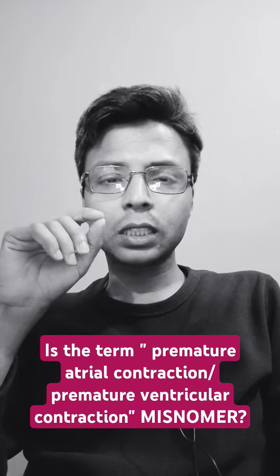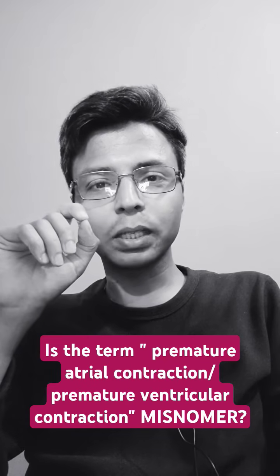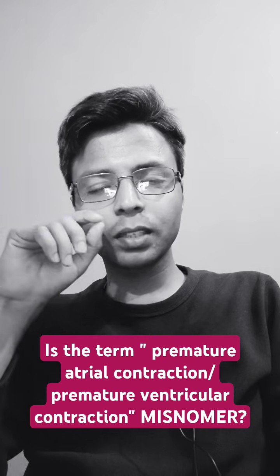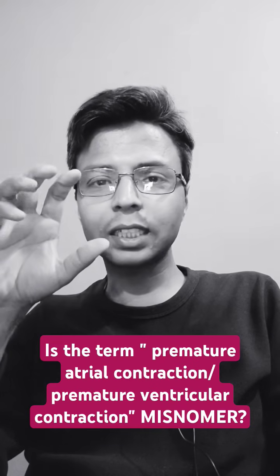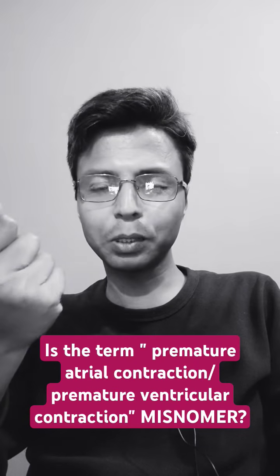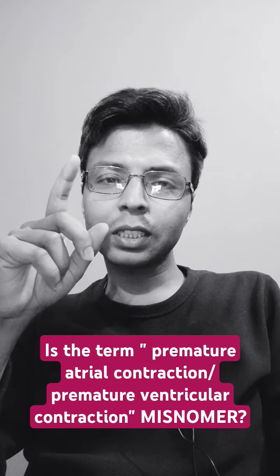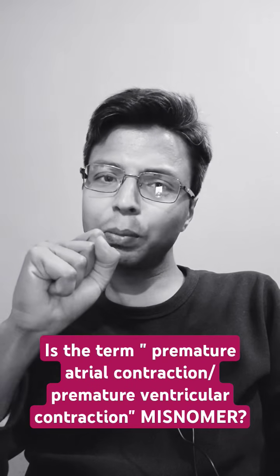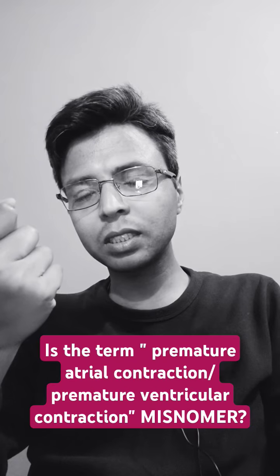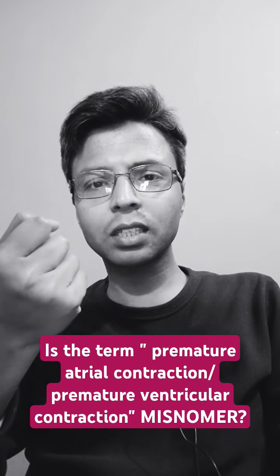So what is premature atrial contraction and what is premature ventricular contraction? What do you understand by that? The atria are contracting prematurely and the ventricles are contracting prematurely. So can you assess from the ECG whether the atria or the ventricles are contracting prematurely? Contraction means a structural change, right?